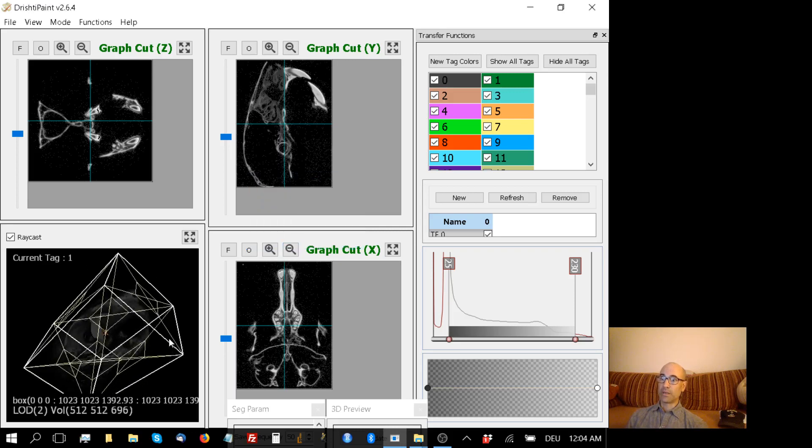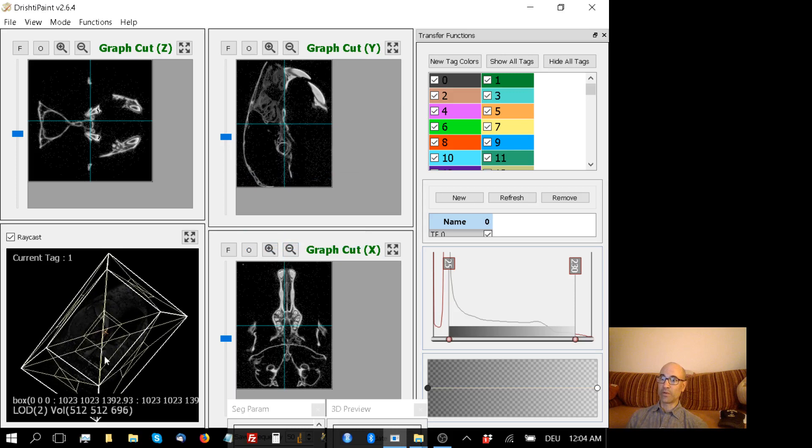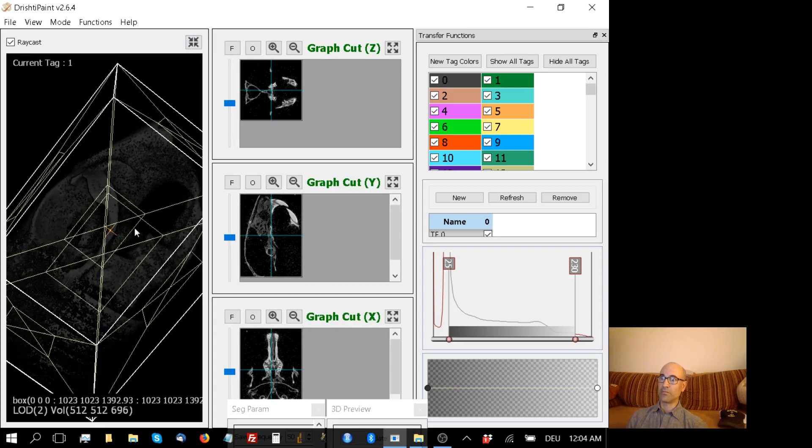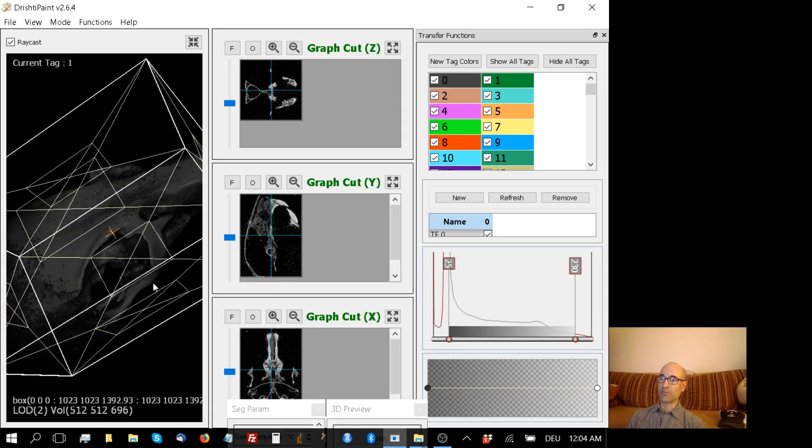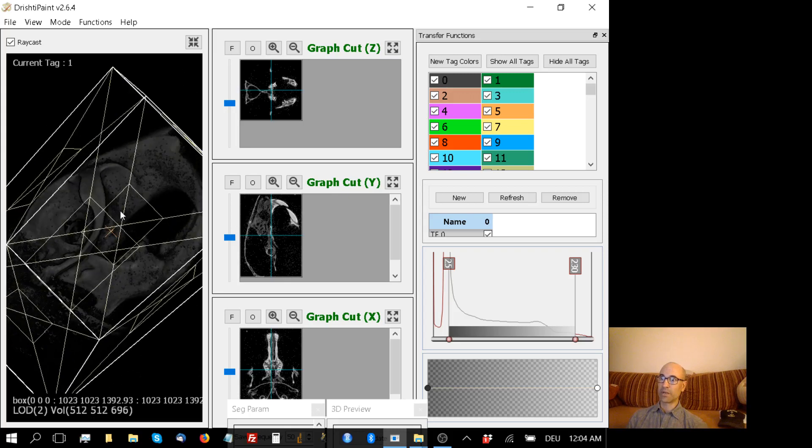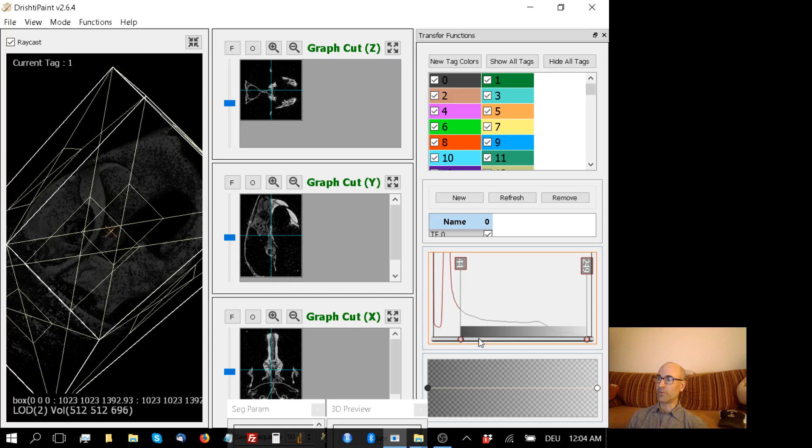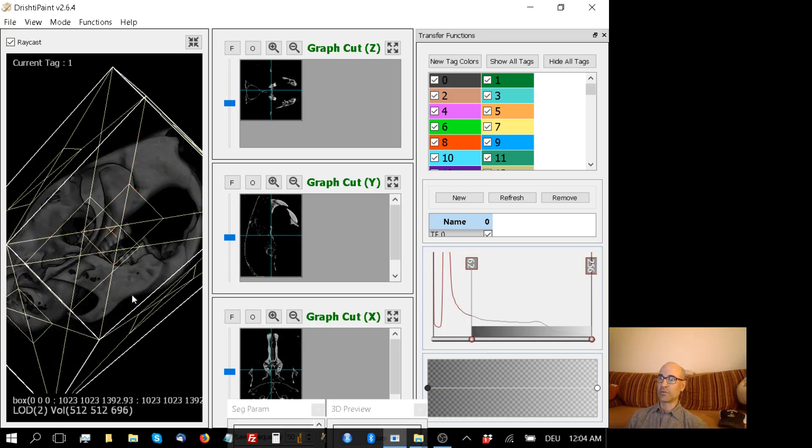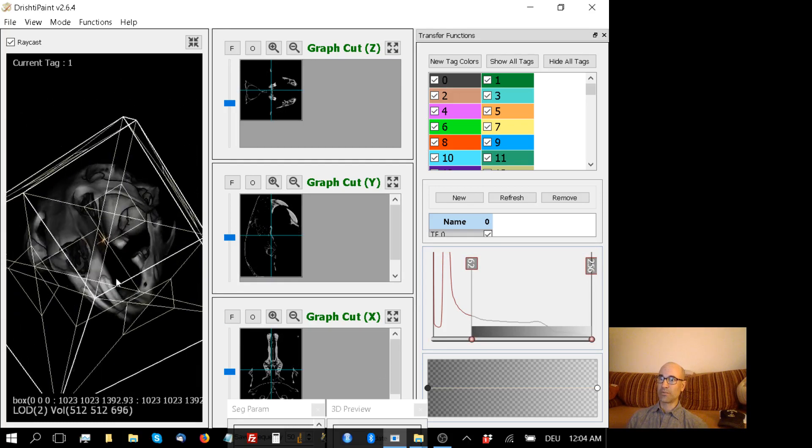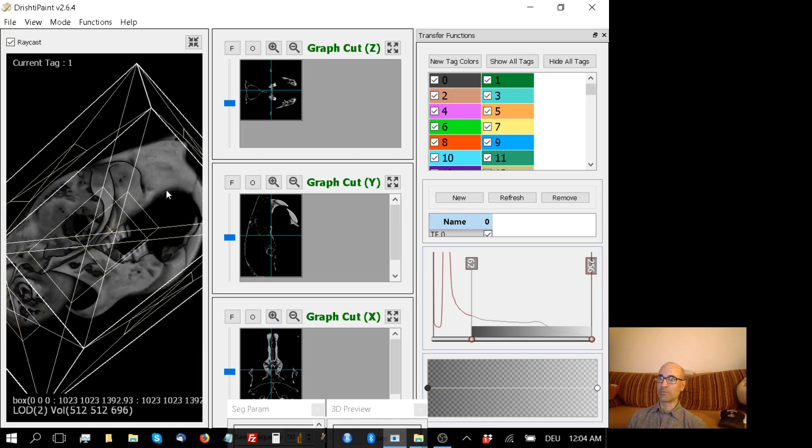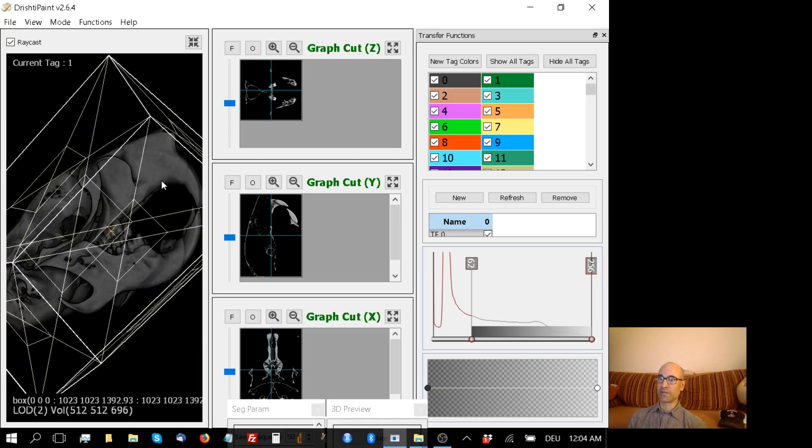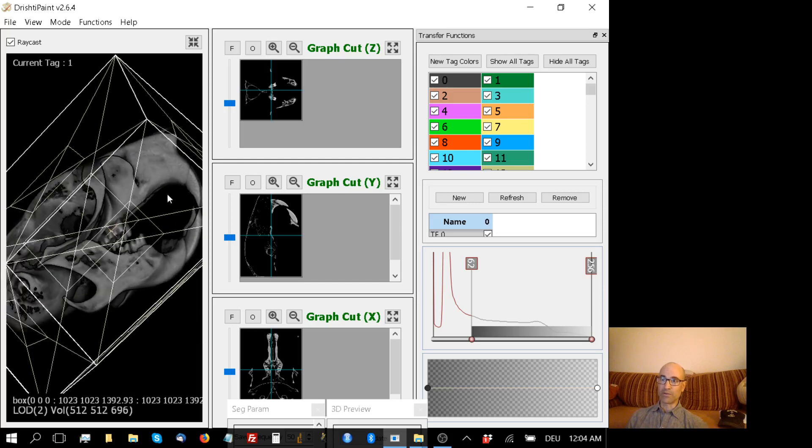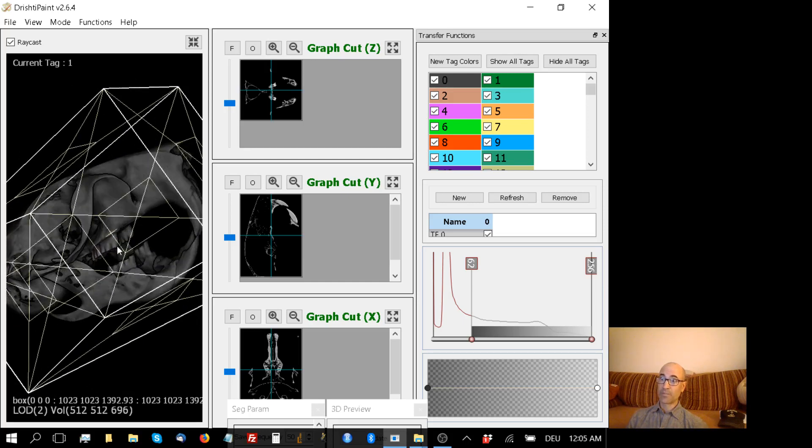It shows me what, at first glance, is a fairly faint rendering of that Mongolian gerbil skull. I can improve that by manipulating the transfer function over here on the right. I want to focus on the somewhat more dense pixels and leave behind all of the styrofoam cup and the plastic wrapping that was scanned, and focus on the bones and teeth. And there they are.